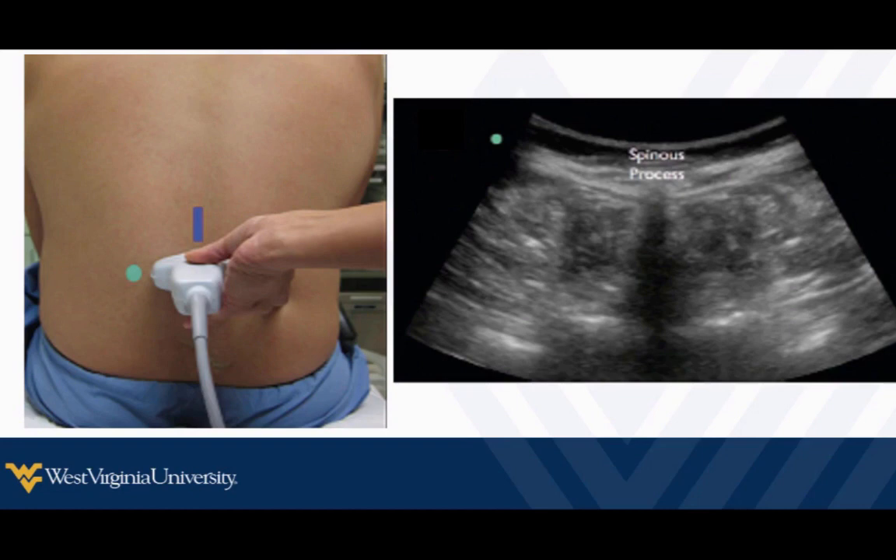So again, get the patient positioned, get your transverse view first. With the curvilinear probe, things aren't going to look quite as pretty, but we should still see that spinous process coming superficially and making a spike-like shadow going down their back. We should see the paraspinal muscles — or the tenderloins, as I like to call them — curving in towards the spinous process. We line this up in the midline using a center marker or cursor, mark their skin, then turn and get longitudinal views and mark that as well.